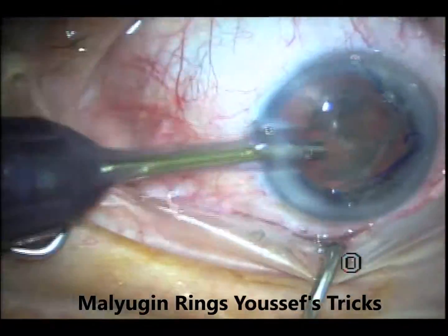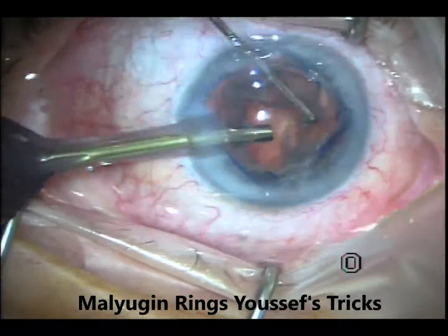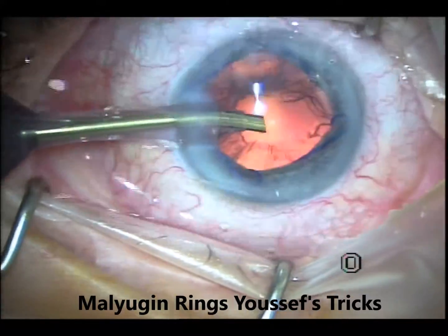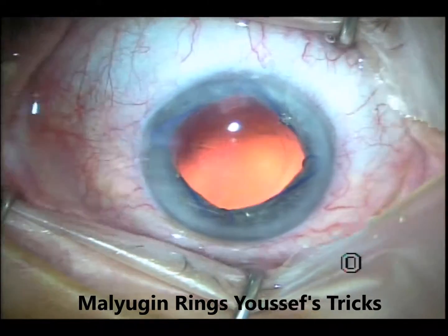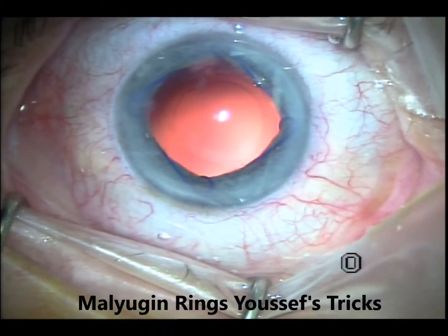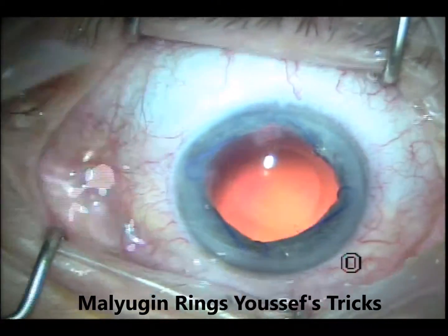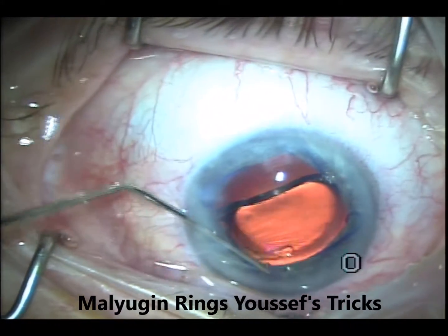These are the regular steps of a phaco. The nucleus was using a chopping technique — I'm just going to speed through this. When you fill the chamber with viscoelastic at the beginning, try to leave some under the iris slightly so that you can have a space to engage the scroll, rather than compressing the scroll against the iris against the lens.